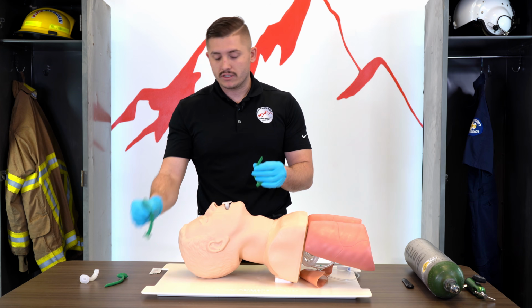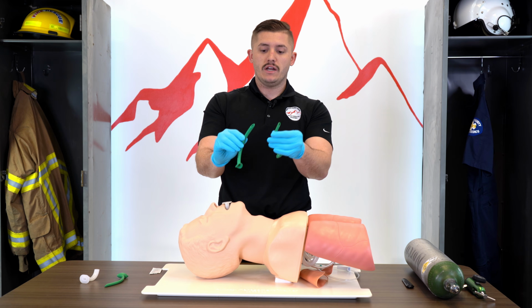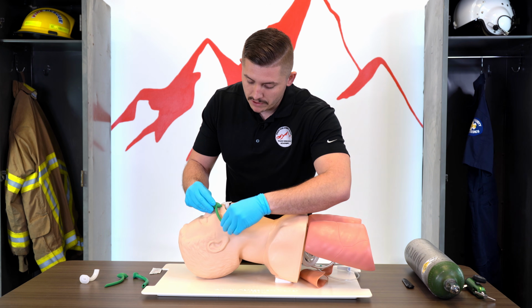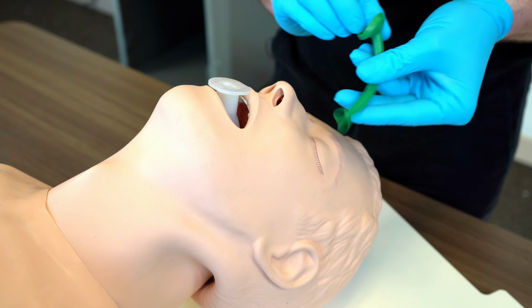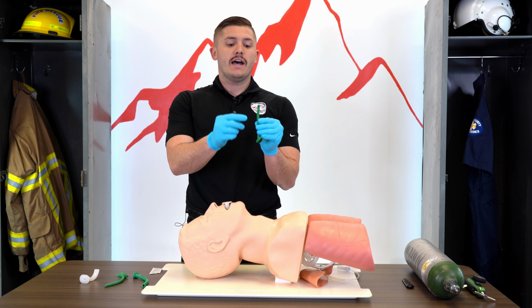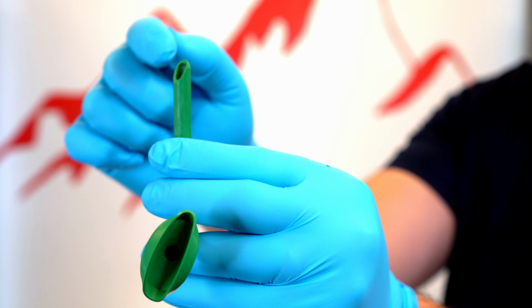Again, these come in all different sizes, okay? Some patients have bigger nostrils than others, but we're going to measure it. So I'm going to measure from the nose to the bottom of the ear, okay? With these, there's a very specific way we want to place these. As you can see on the NPA, it has a bevel. That bevel is going to go towards the septum.